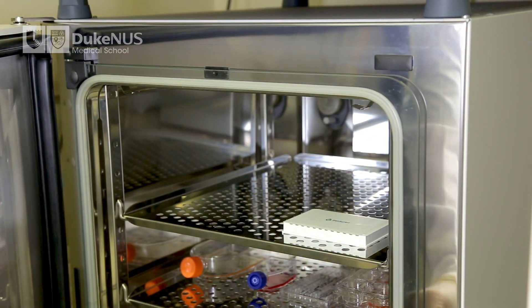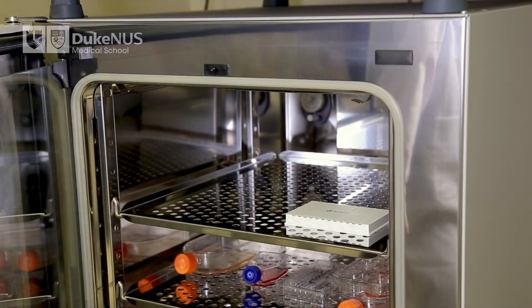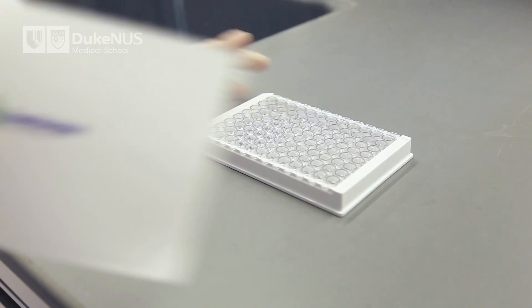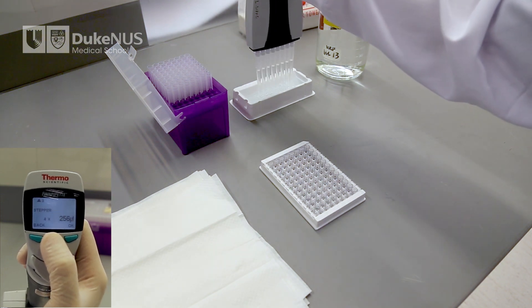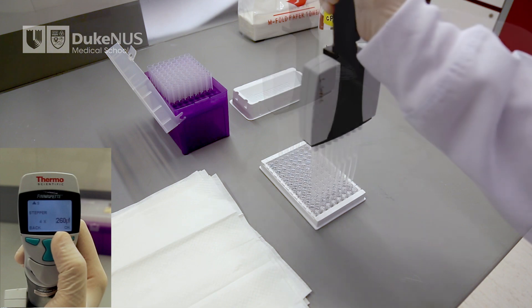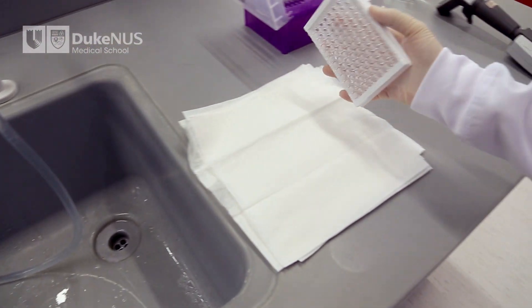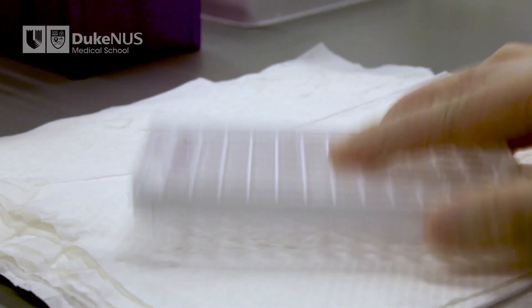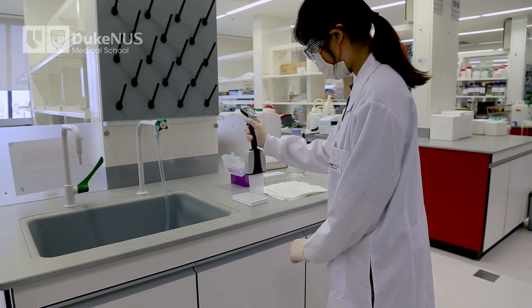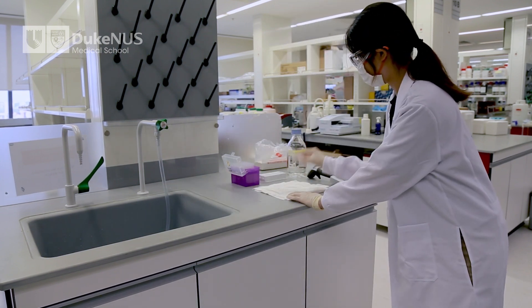Incubate the capture plate at 37 degrees Celsius for 15 minutes. After the 15-minute incubation, remove the capture plate from the incubator. Invert to remove the sample mix from the plate. Wash each well with 260 microliters of the one-time concentrated wash buffer. To remove the wash buffer, tip the plates over a sink and tap the plates on a stack of paper towels to dry. You may also use a microplate washer or multi-channel pipette to remove the wash buffer. Wash the plates three more times. After the fourth and last wash, tap the plates dry before proceeding.